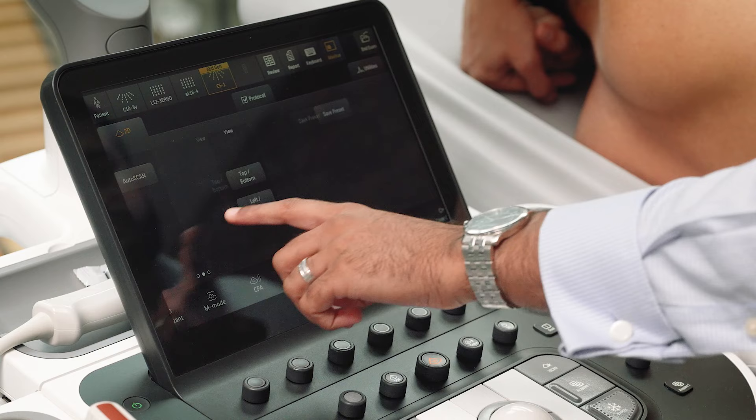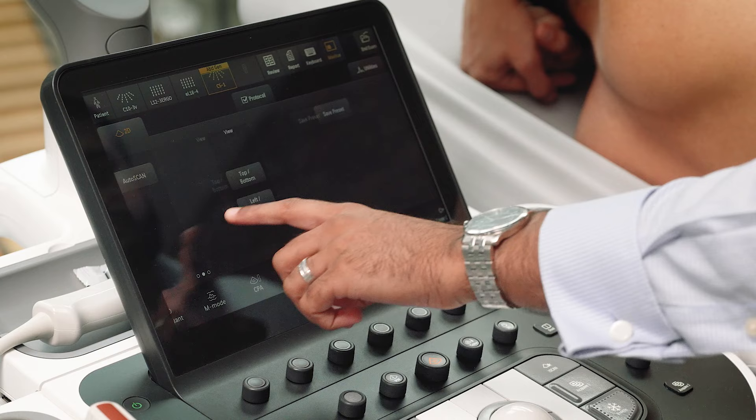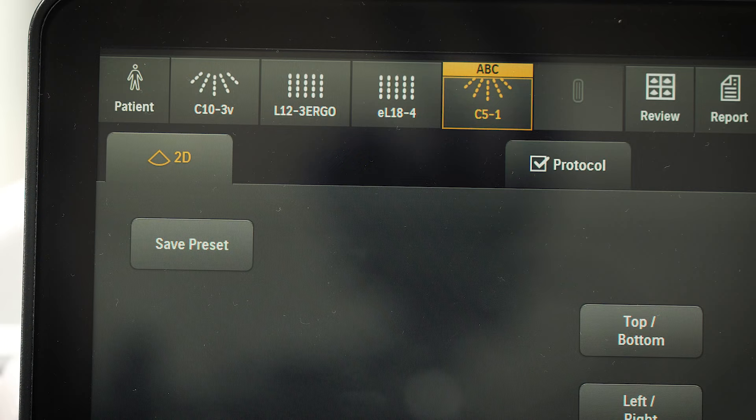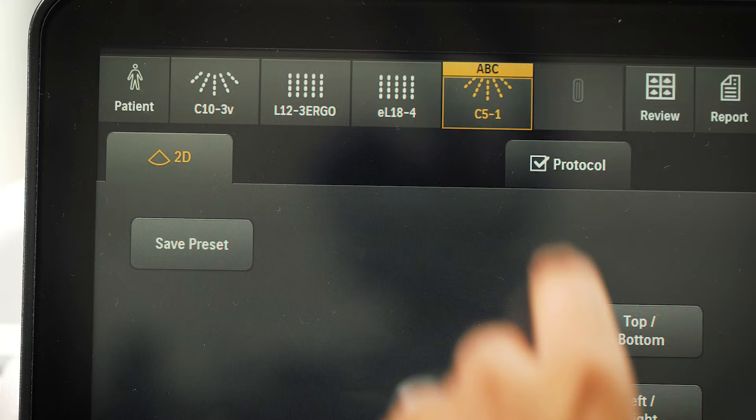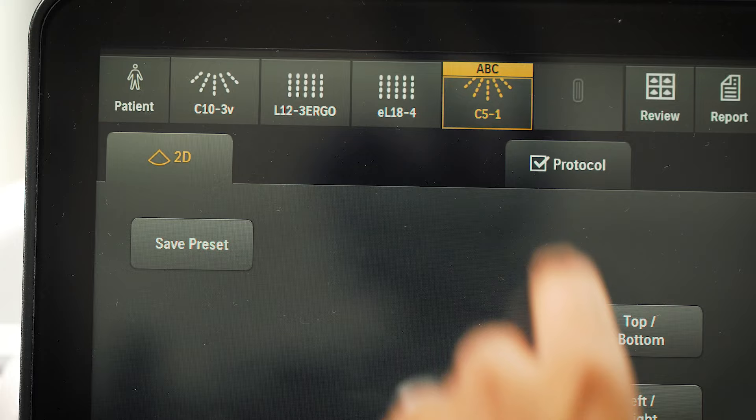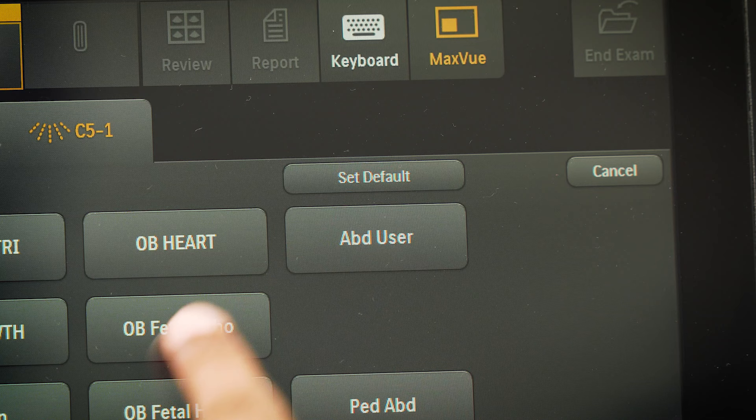It is possible to save your desired image settings. This is done using the save preset button — give your preset a suitable name. This will be saved under the transducer tab. Your desired preset can also be set as default to help reduce scanning time.